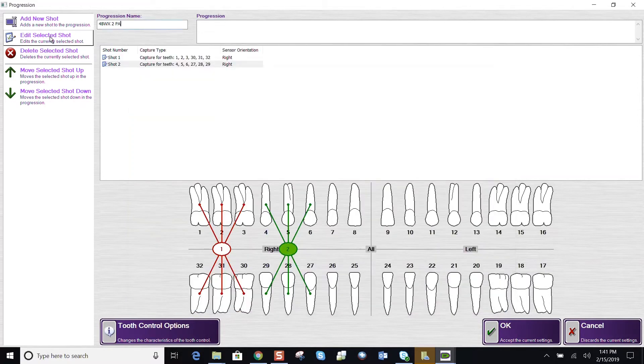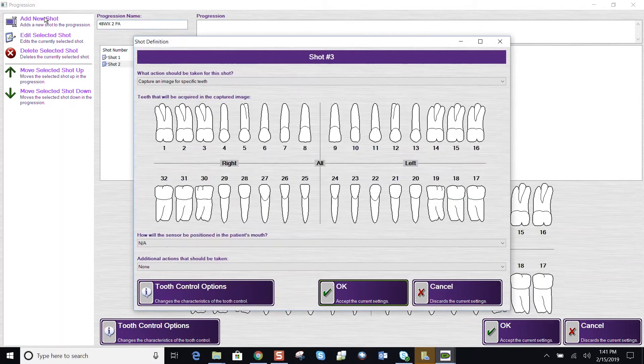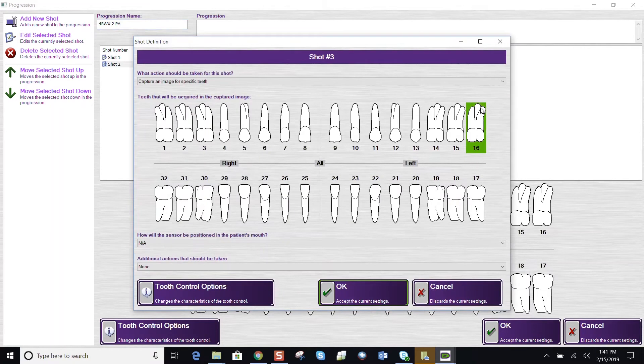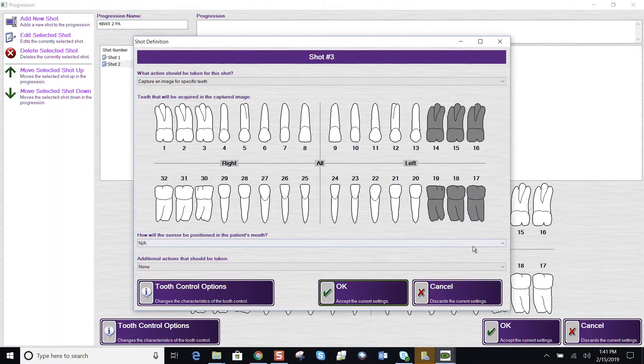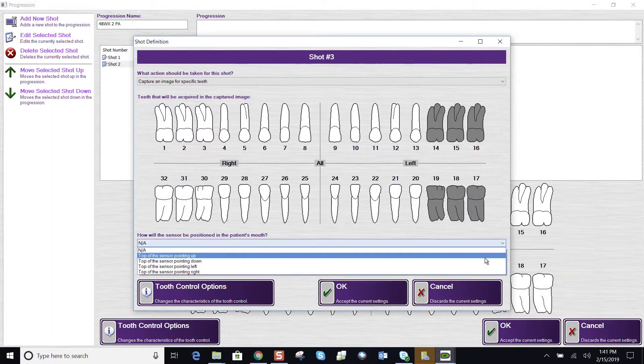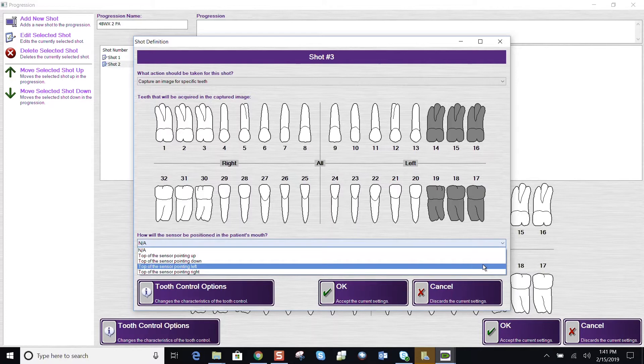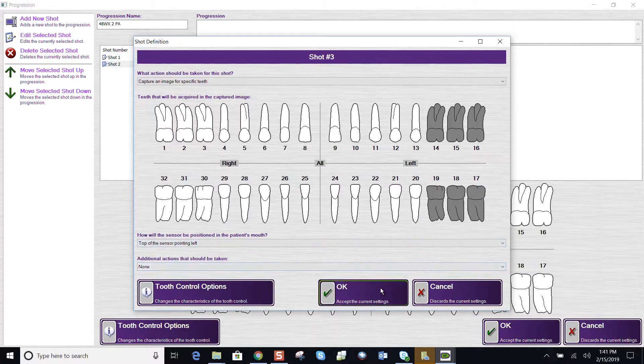My third shot, let's add a new shot. Highlight the teeth we want associated. The sensor orientation is now to the left. And we say OK.